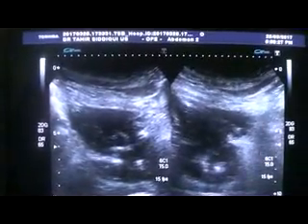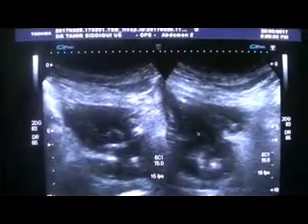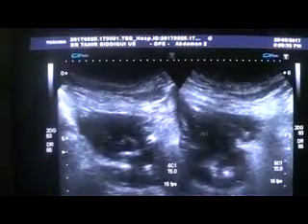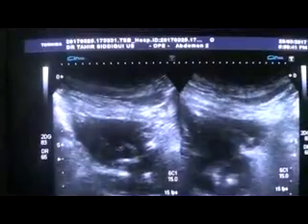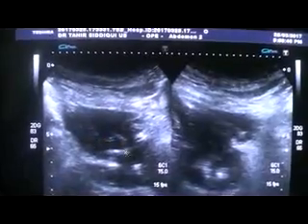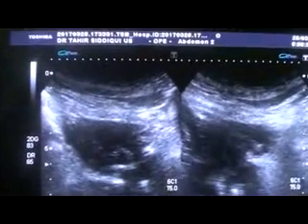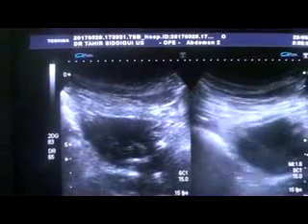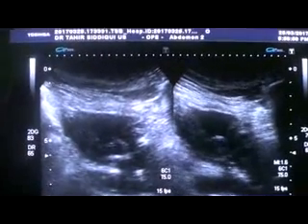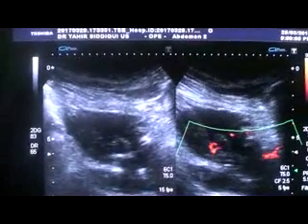Now you see that this prostate is continuing with this echogenic area that is indenting into the wall of the urinary bladder, the posterior wall. Same is the case over here. This is the longitudinal view, and this is the UB lumen. This is the urinary bladder echogenic area layered along its posterior wall. This is the prostate, and there is history of TUR a few years back, and what you see is there is vascularity within this echogenic area.